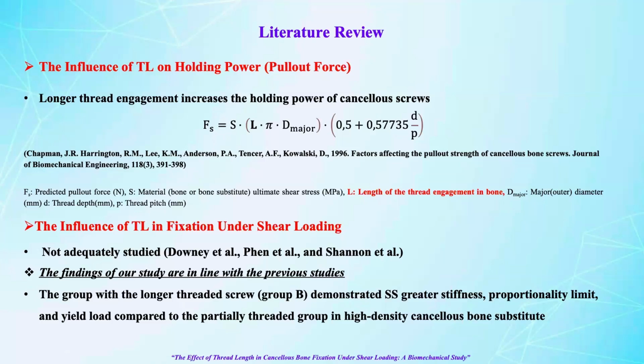The findings of our study are in line with the previous research because we also found that the constructs fixed with the long threaded screws had a better mechanical response than those fixed with the short threaded screws.